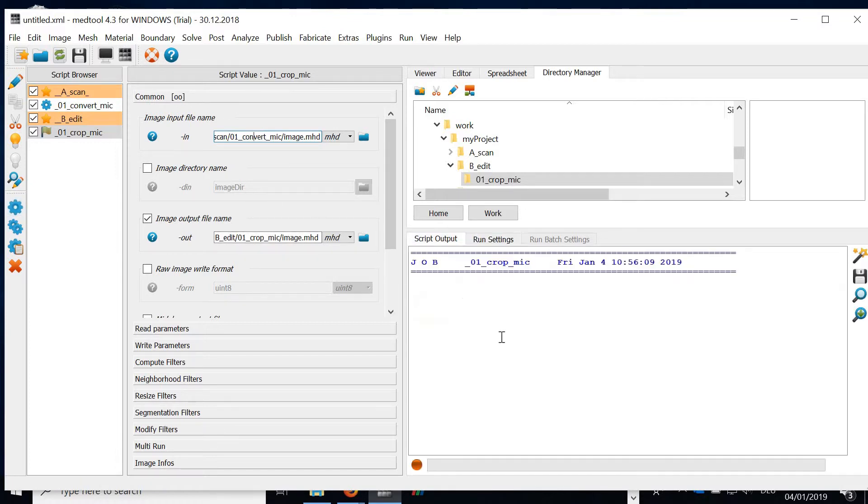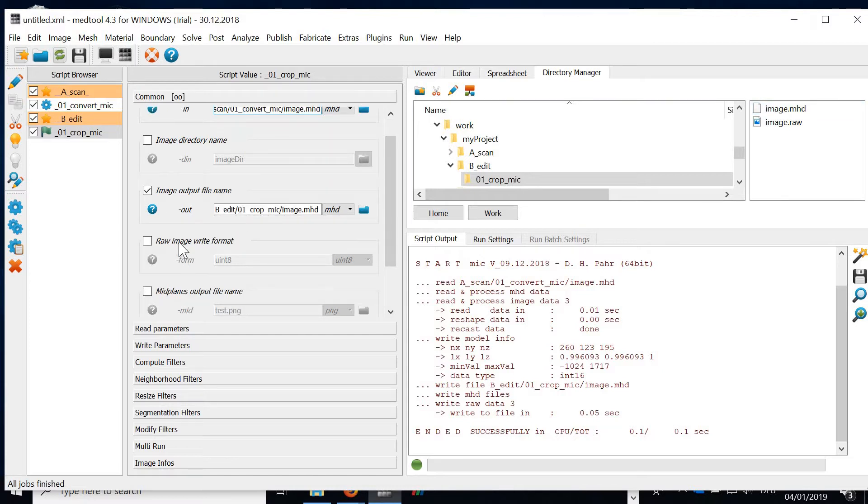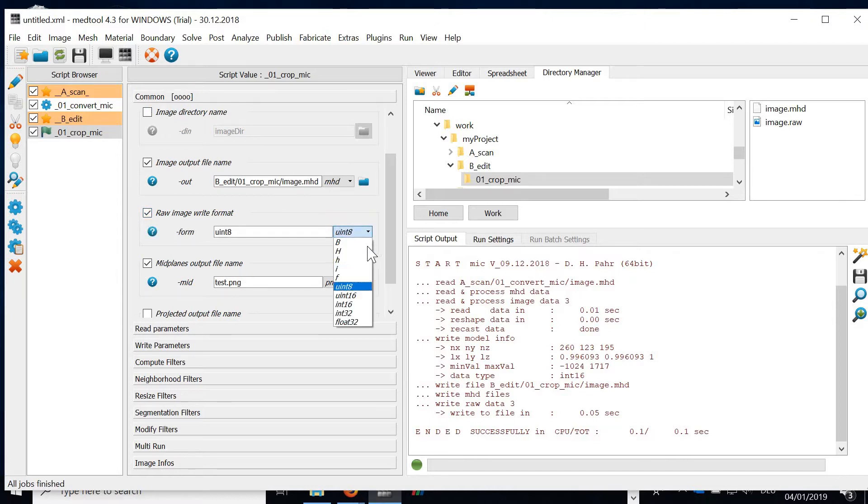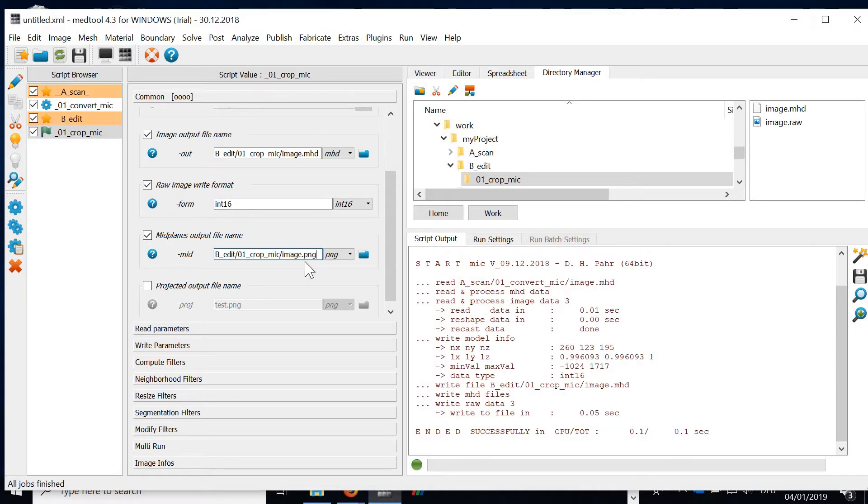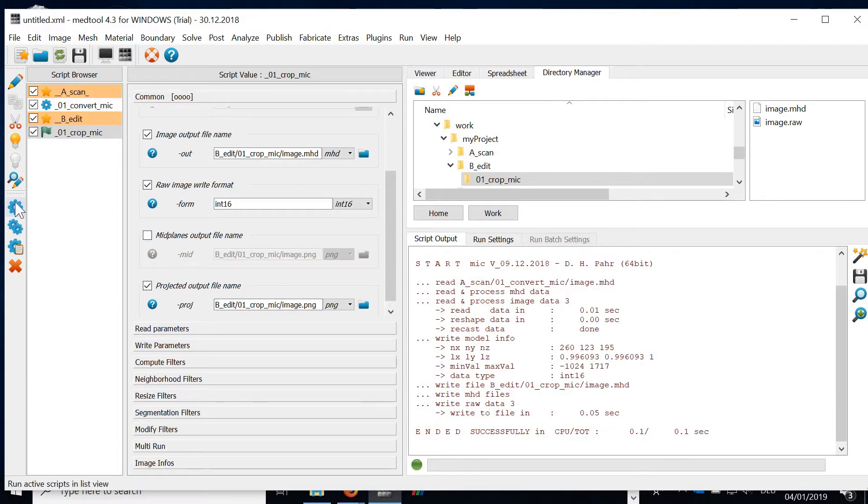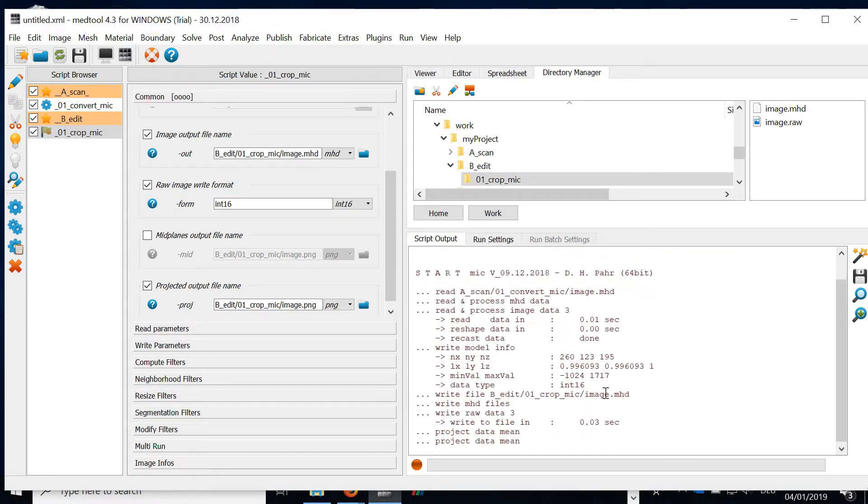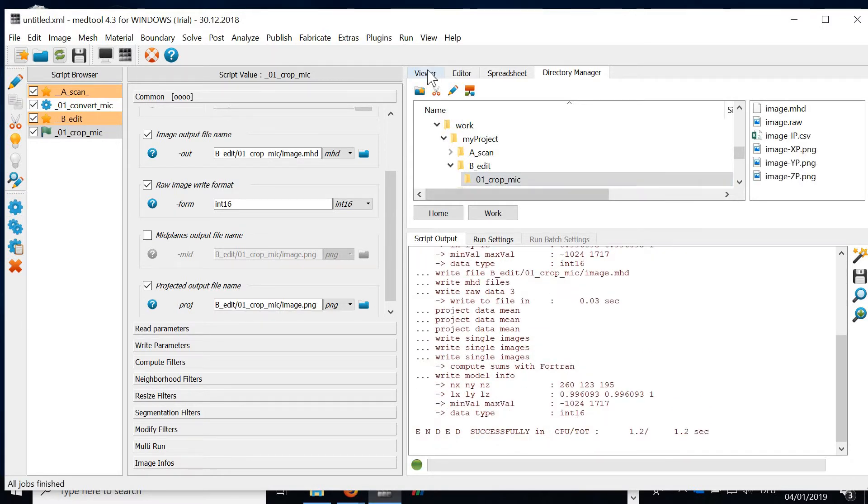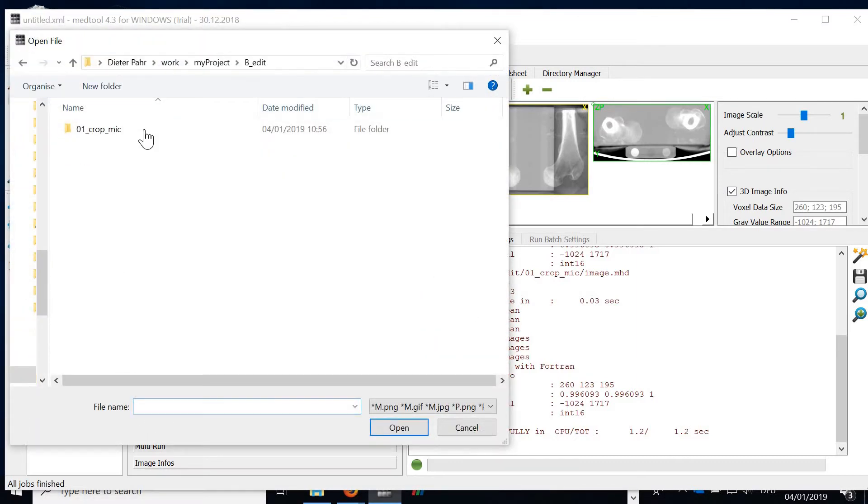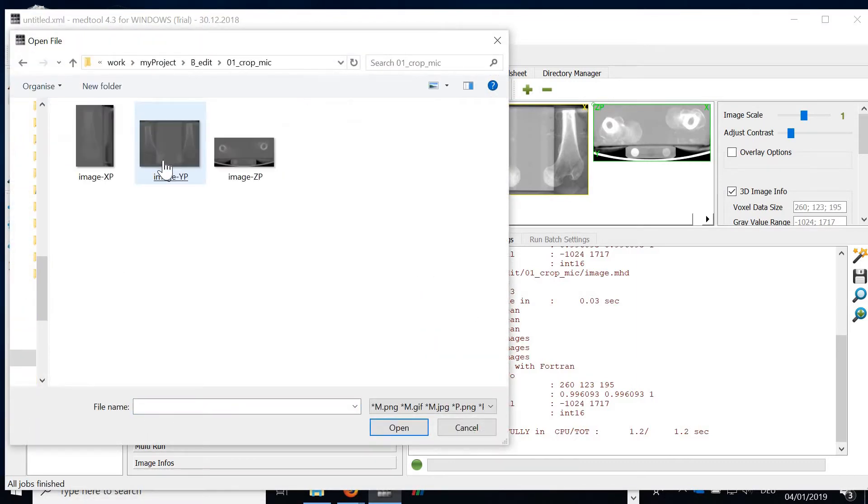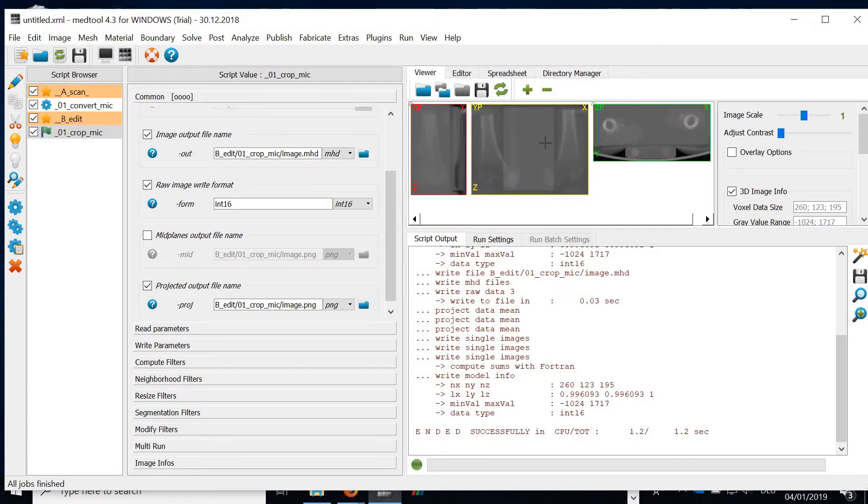So always, if you have small files, try out if everything works fine. We have now the images converted. We can also output, for example, the mid-planes. I would also change the format here. We can output the projected images. In our case, we will only need the projected images. So if you let this run and we're looking into the viewer, we'll get, of course, the same result because we did not modify anything.